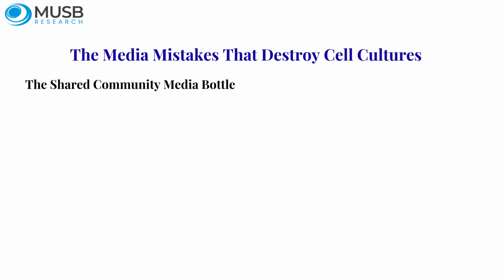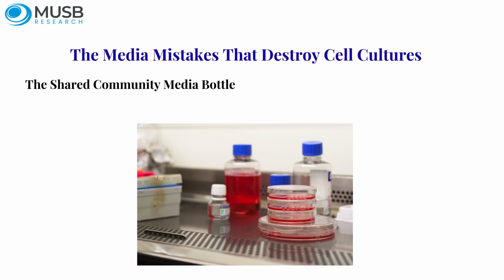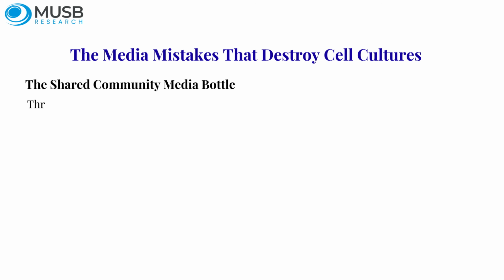The shared community media bottle. Now for one of the most infamous problems in training laboratories. The shared community media bottle. A bottle left sitting on the bench for days, repeatedly open, sometimes uncapped, used by multiple people. This creates three major problems simultaneously.